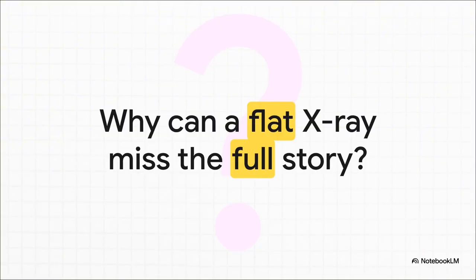I mean, think about it. Is your head flat? No. Is your jaw flat? Definitely not. And your teeth? Come on. So why have we been looking at them with flat pictures for so long? That's the big question, right? Because a flat X-ray, well, it can miss the full story.